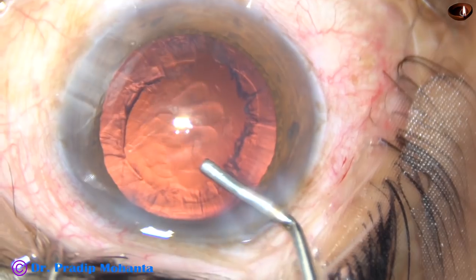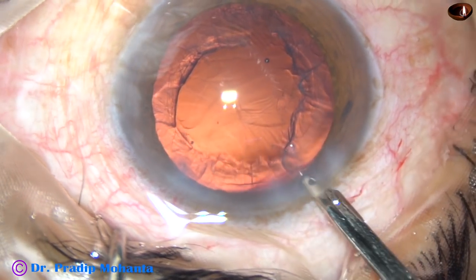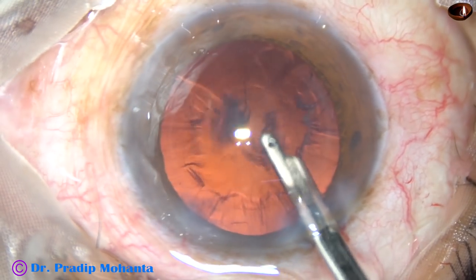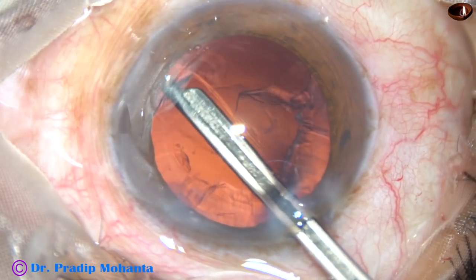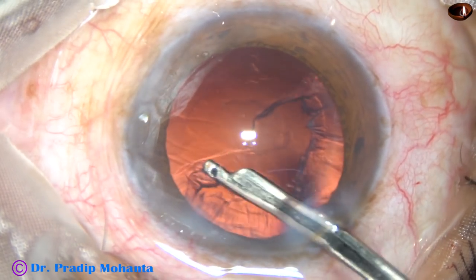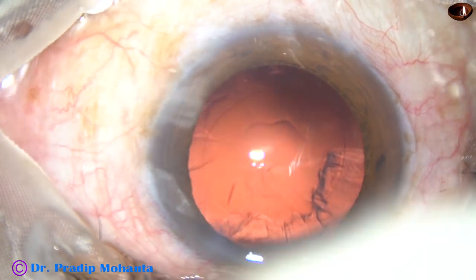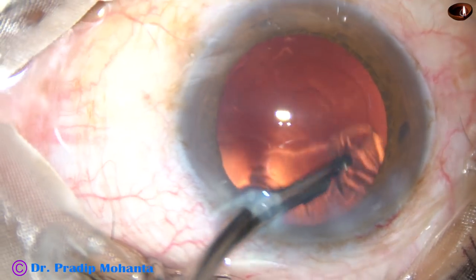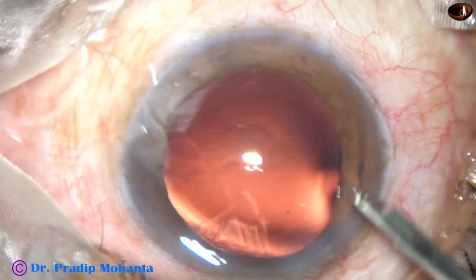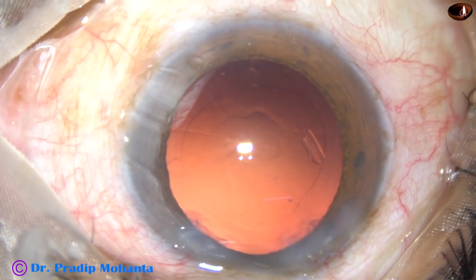Since there is only one side port, you can use a coaxial I/A or a Simcoe cannula. This is a 23-gauge Simcoe. See how beautifully you can remove the cortex with this Simcoe — go underneath the anterior capsular rim, hold a portion of the cortex, pull it towards the center and aspirate. You can create as much vacuum as required with your left hand. Go through the side port and remove the cortex. If you hold the posterior capsule, you can flush out whatever you have aspirated and it releases the posterior capsule.